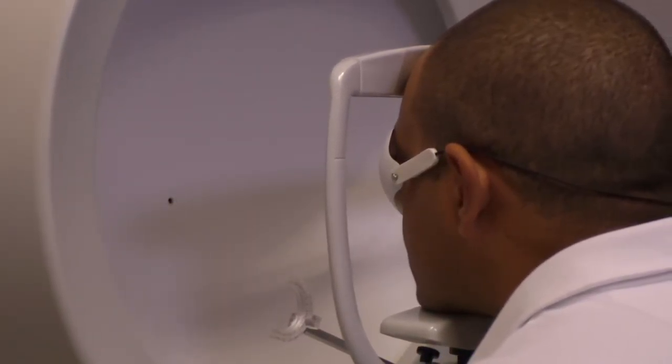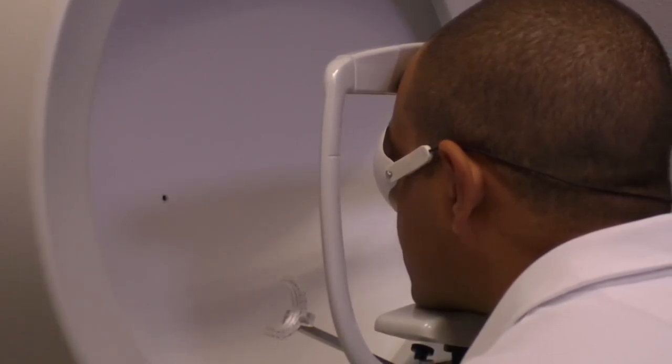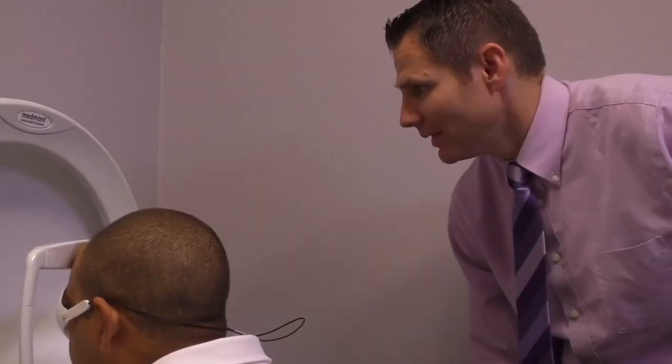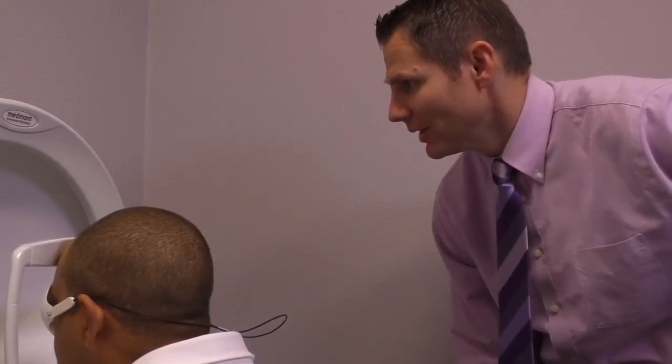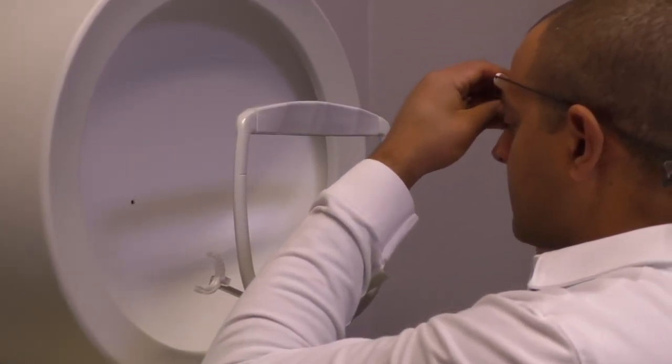All right. Doing great. Keep looking straight ahead there. Go ahead and sit back, and then we'll switch eyes.